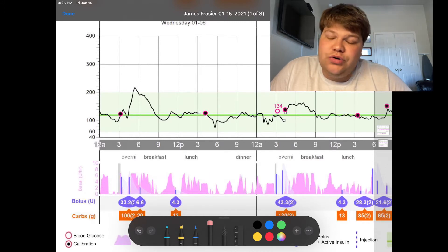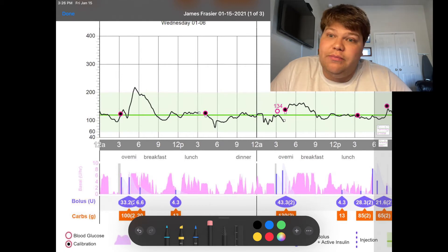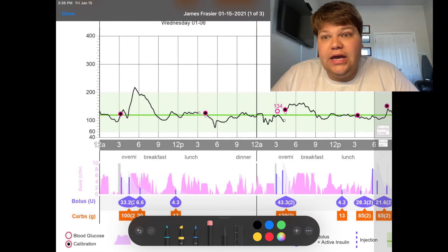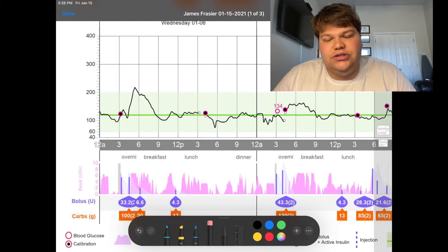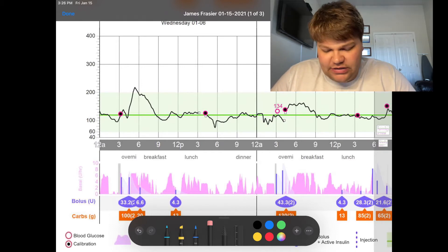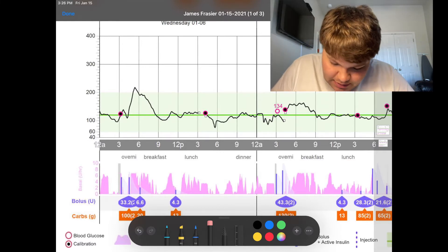My blood sugar — you can see my finger stick — when I'm getting up and getting dressed, my sugar's on the rise. That's because I'm disconnecting my pump before 3 a.m. to take my shower and start getting ready for work. That's the first little rise. But once I switch my pump back on, there's a little spike in auto mode — you guys will be able to see it.